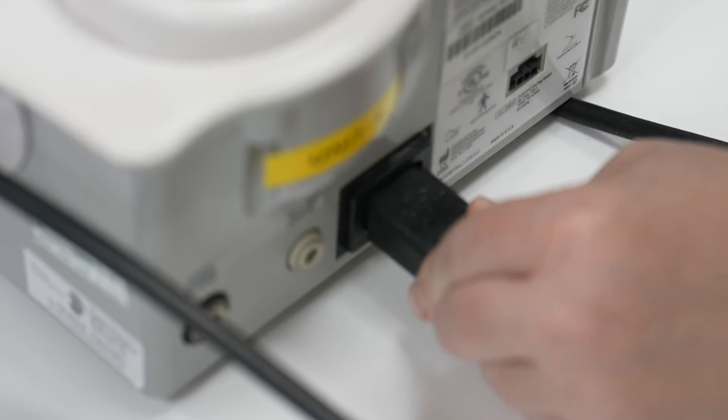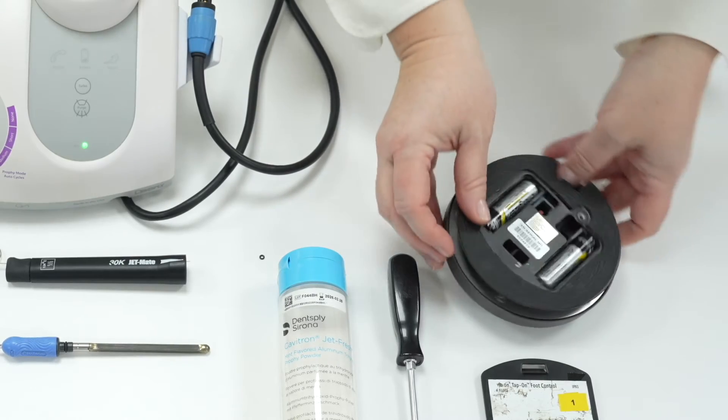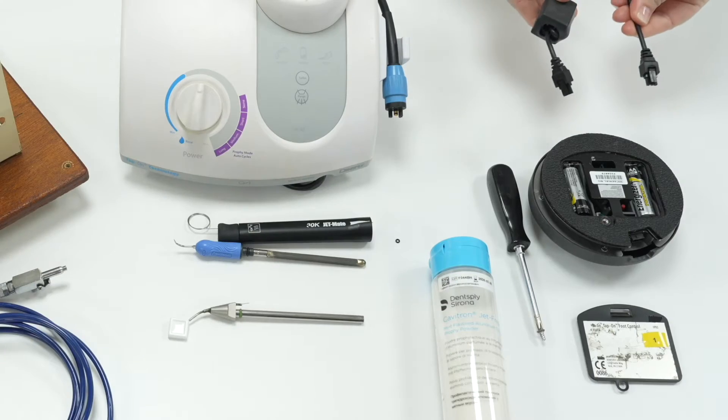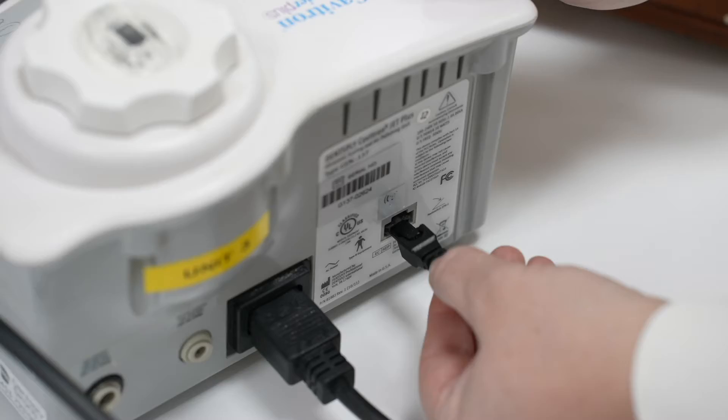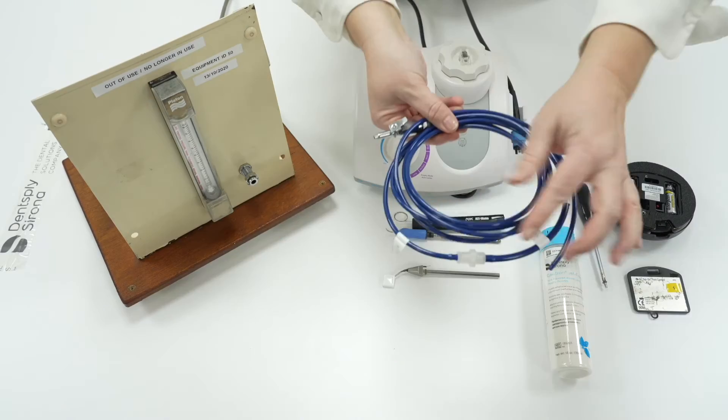The power cable is a standard kettle lead and the cordless tap-on foot pedal takes AA batteries. Should they run out there is an optional cable to plug in the foot pedal. The Cavitron Jet Plus includes an air line and water line with filter.